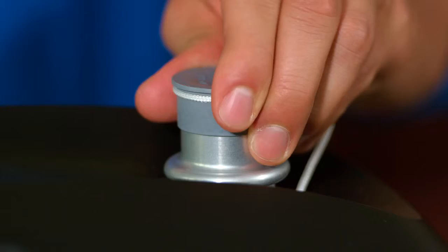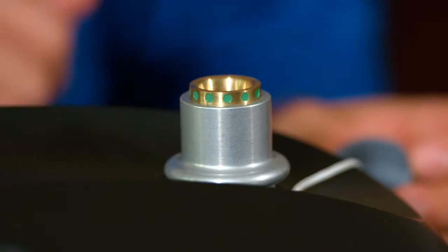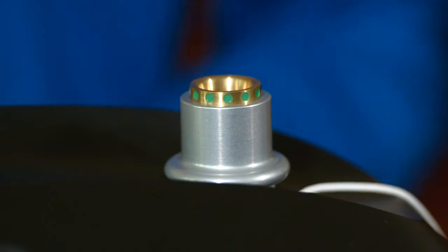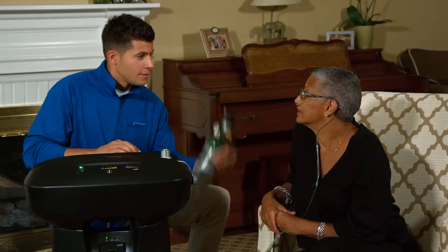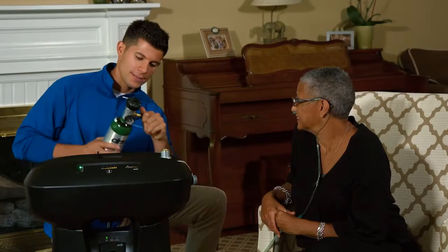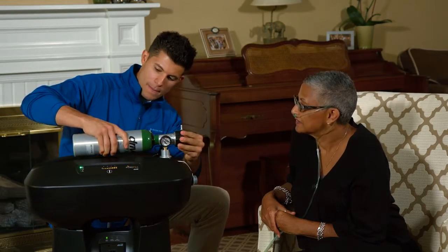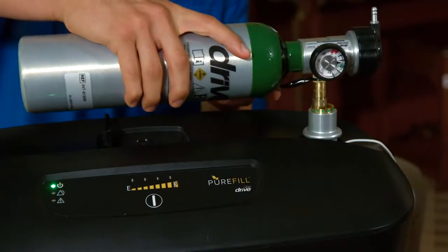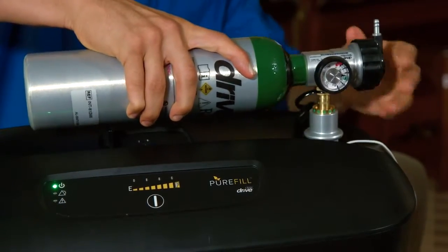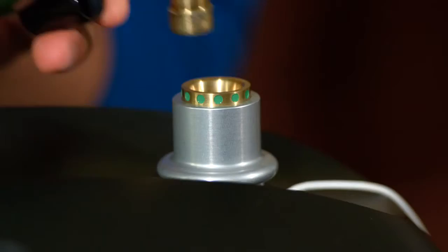Remove the protective cap from the cylinder port, and verify that the green dots are showing, indicating that the port is in the correct position to receive the cylinder. Flip the support stand up for the cylinder, and with one hand firmly on the cylinder and one hand gently pushing the coupler down, slide the brass transfill valve into the port coupler, releasing the coupler, connecting the cylinder.